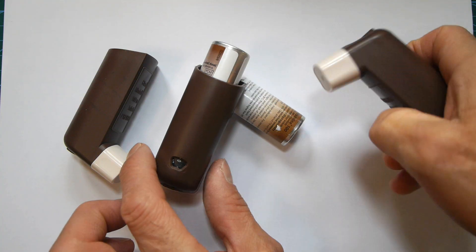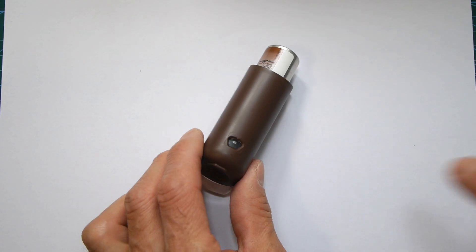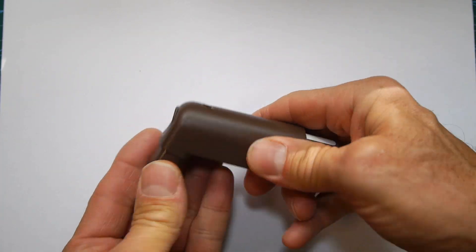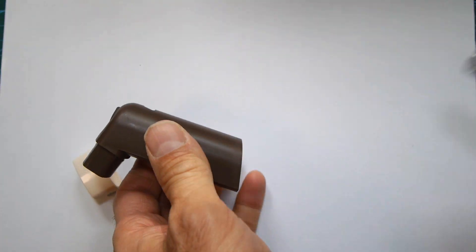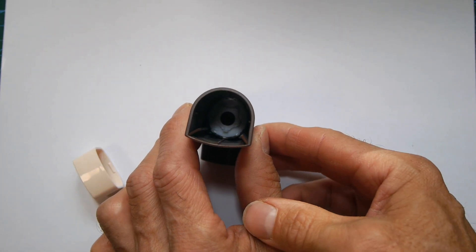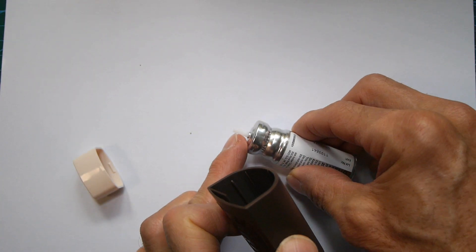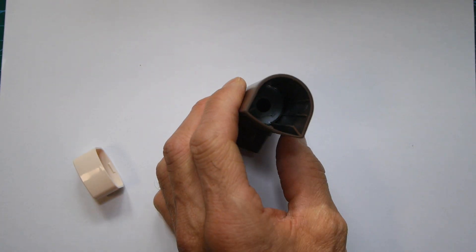So the first thing we've got to do if we're going to understand how these inhaler counters work is we need to remove the inhaler from the brown case. So we'll just take it apart and take the canister out and deep inside there you might see that white bit is the bit that picks up the tip of the canister.